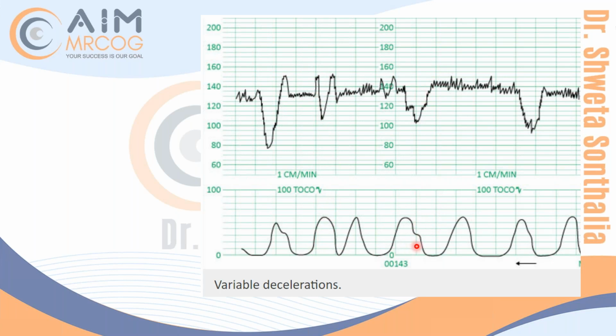This is also not mirroring the uterine contraction. But to me, it looks like a mirror. See, this is the contraction. The sudden onset and the acute peaks are there, and they are variable. Acute peaks, yes, I understood that. But still, I feel that it is corresponding with the contraction and looking like a mirror image to me.